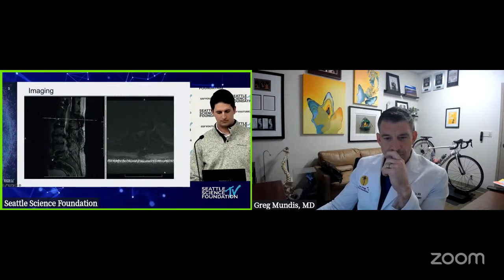The overall alignment is not too bad. PI-LL mismatch is really 12 degrees, positive sagittal alignment but within normal, and then a mild dextroscoliosis between T11 and L4 of 10 degrees. Sagittal and axial MRI demonstrates reherniation of this L3-4 disc with caudal migration causing pretty significant central stenosis. So 2 levels below that thoracolumbar fusion, he has blown out a disc. Below that, he has had laminectomies and a single level fusion.